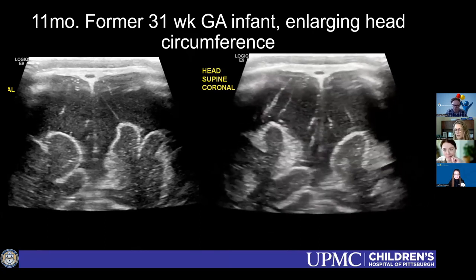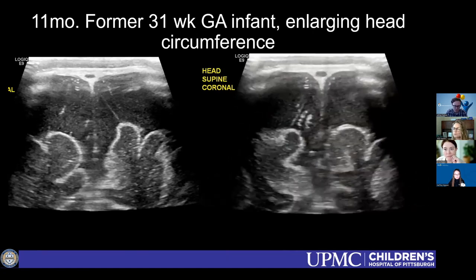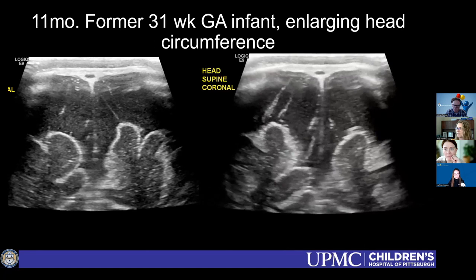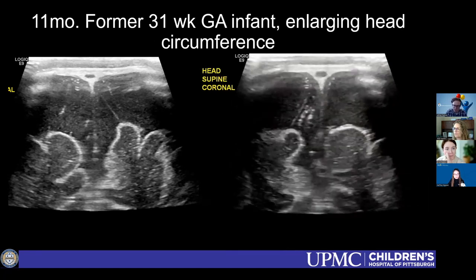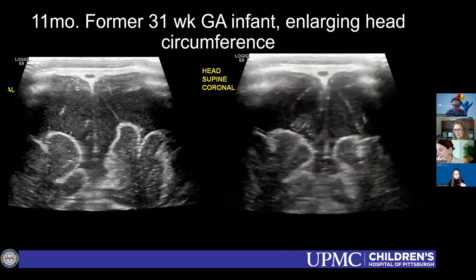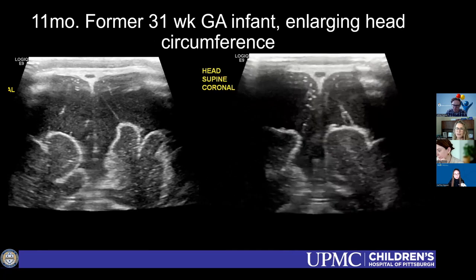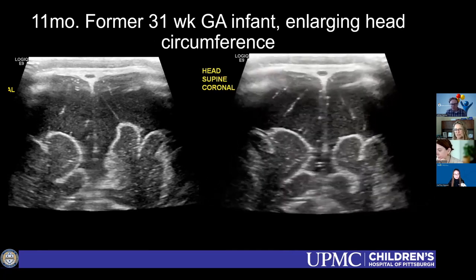Most commonly benign macrocrania is like 6 to 9 months, and usually the ventricle size is normal, but sometimes it can be large. But we've had several cases where we have a former 22-week kid who now has big ventricles or big extraaxial spaces, and it's probably not just benign macrocrania. I don't know if you guys have any light to shed on that.